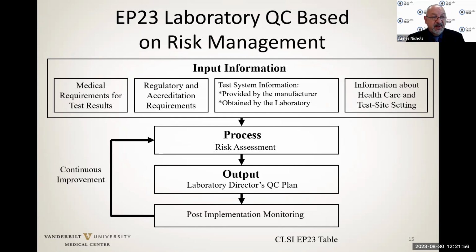We also have to understand information about the healthcare setting. Who's running the test? Is it in a clinical laboratory under well-controlled temperature, humidity conditions, or is it out on the floor? Is it in a car somewhere being driven around the city by a visiting nurse, where it's exposed to different temperatures, different conditions, and non-laboratory trained operators?